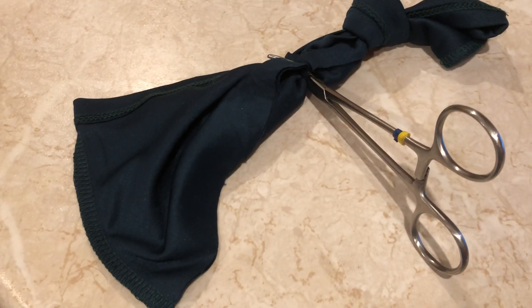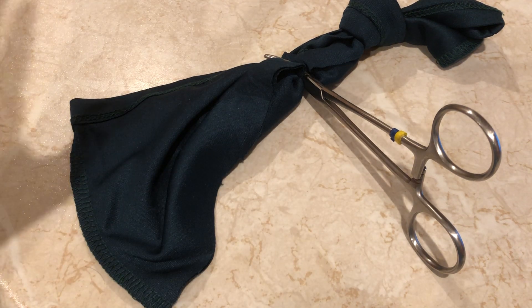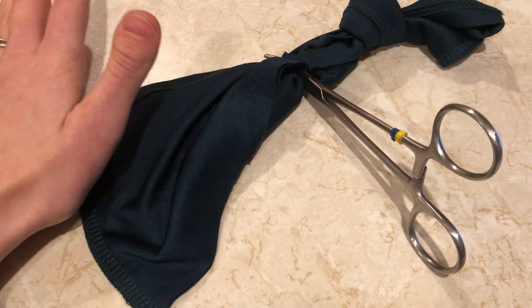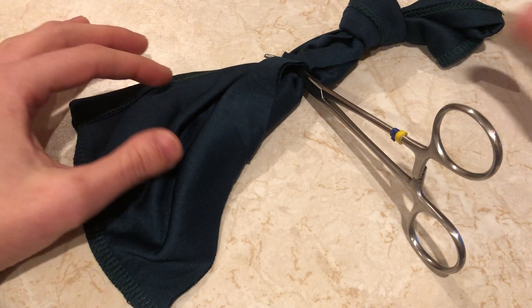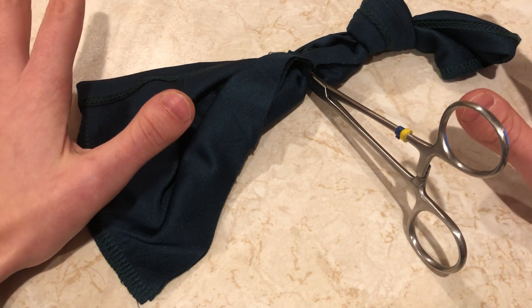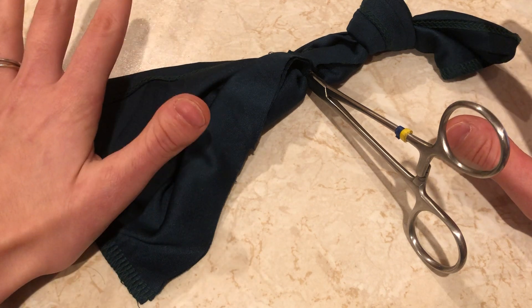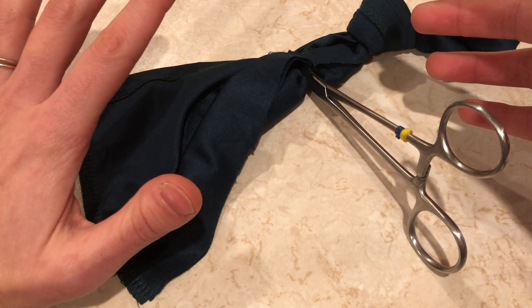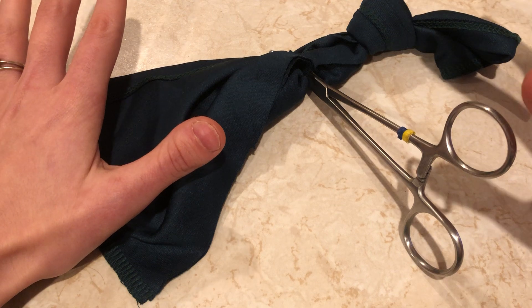I'm going to show you the constrictor knot, which was recently mentioned in the VET Times, and it's one of the most secure knots you can use. I've recently started using it on my ovarian pedicles for bitch spays and I find it brilliant. I do it a little bit differently to how they've shown it diagrammatically in the VET Times article, partly because I don't feel comfortable transecting anything before I've got a knot on, and I find it works really well for me this way.